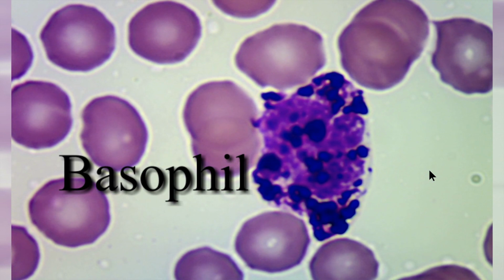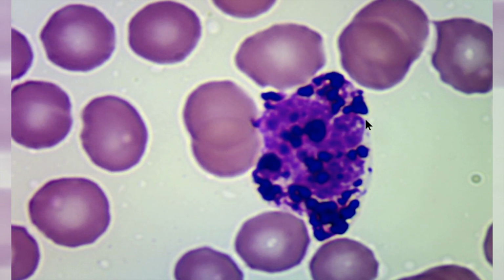You can see the size of the granules that are present in this basophil. The nucleus is difficult to discern. However, it looks like a segmented nucleus, but it's difficult to identify exactly what the shape of the nucleus is. However, you can see the size and the color of the granules that are commonly seen in basophils. There are many basophils in which the granules are so abundant that you cannot see the nucleus at all.